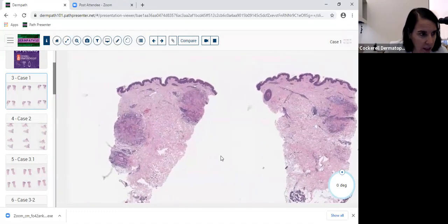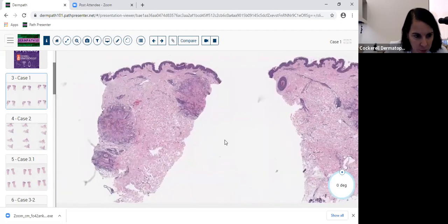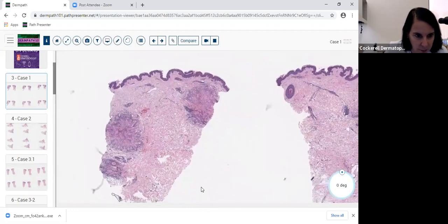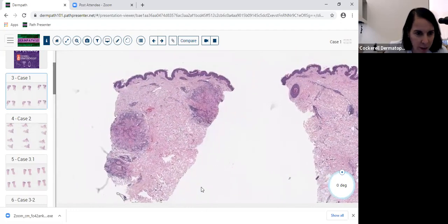So this is our first unknown. We're going to go through a series of unknowns. We have a beautiful punch biopsy here, and it's actually going down into the panniculus, so they did an excellent job taking this punch biopsy. They were very suspicious of a dermal process and an inflammatory process. So they did a punch, which is really, really important.